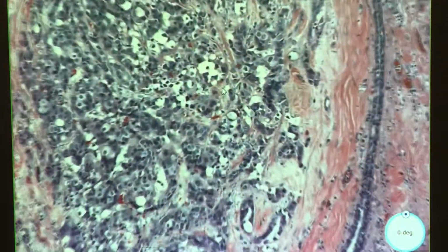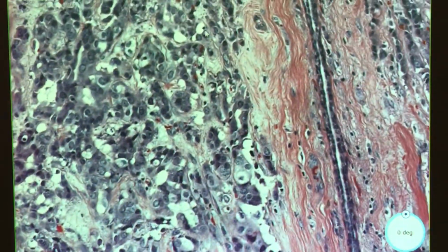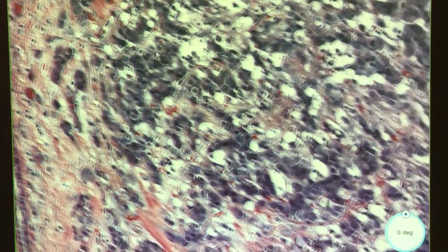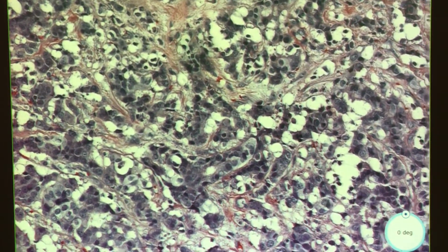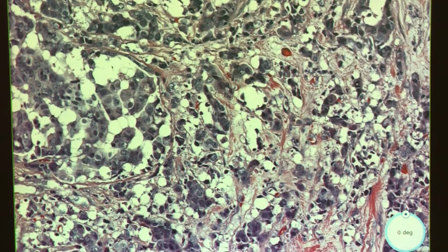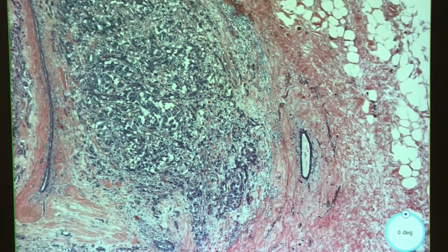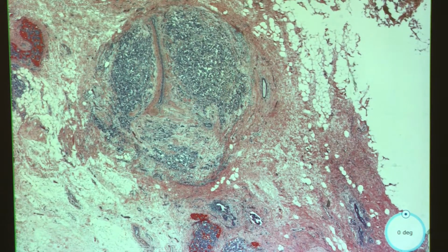This is chock full of invasive carcinoma, and it's too much for me to ignore. My notes say I found quite a few mitotic figures, but I wouldn't necessarily argue with someone if they wanted to call this a grade 2. It just looks too ugly to me to sit there, but okay. So we have our low-grade tumor and our high-grade tumor.